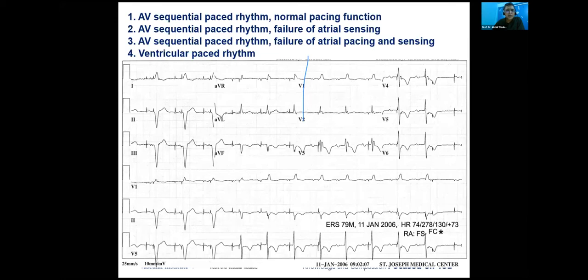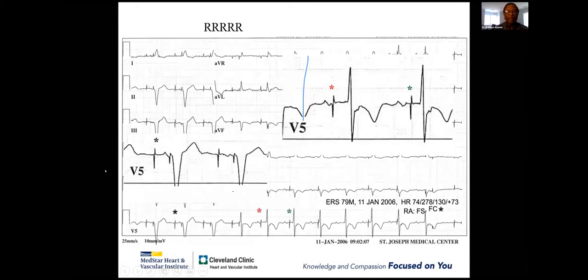It seems that there is no pacing at all. But there is somewhat failure of the atrial sensing and pacing, but ventricular sensing is quite all right. I liked about the answer Rafique bhai gave, on the answer sheet, that there is no comment about the ventricular lead. That could have been problematic. Okay. And then the pacing spikes are in the PR segment in the middle complexes.